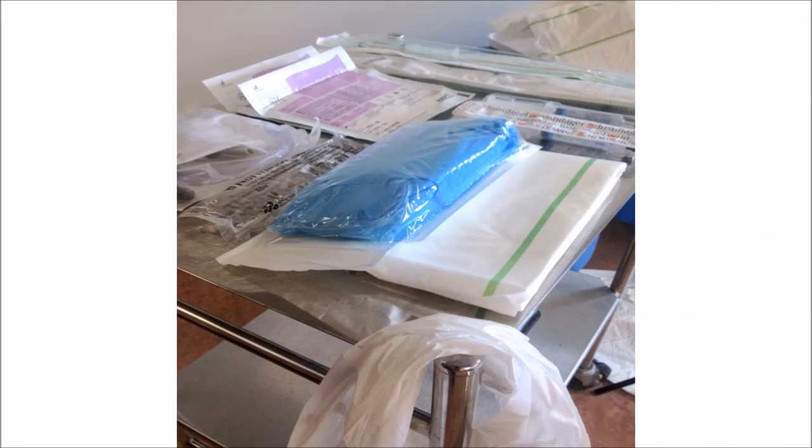Today I'm going to show you how to do male urinary catheterization. First, clean your hands and then clean your trolley with an alcohol wipe. Then you're going to set up onto your trolley. The first thing you're going to do is open a sterile catheter pack.